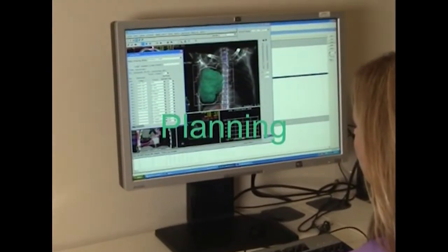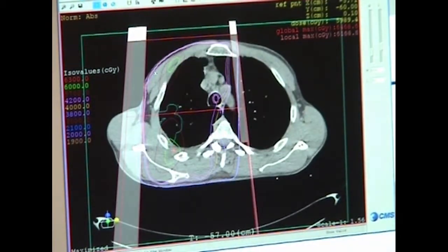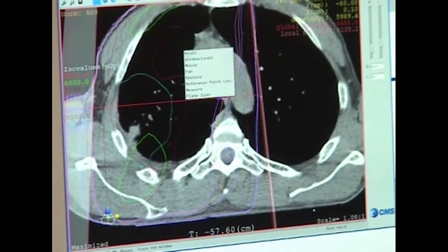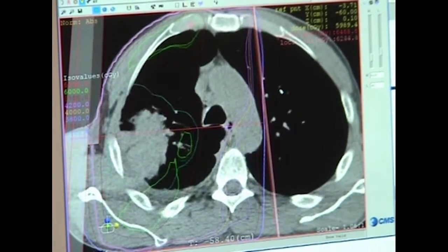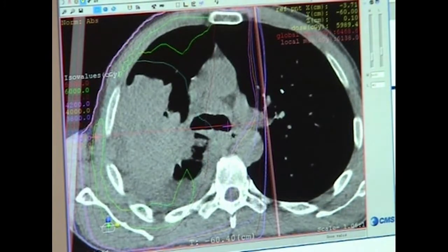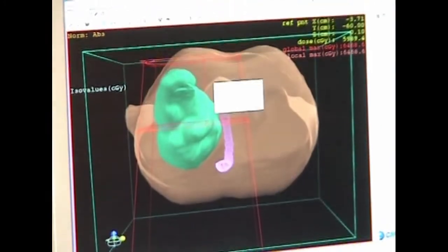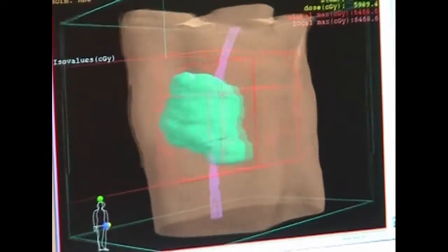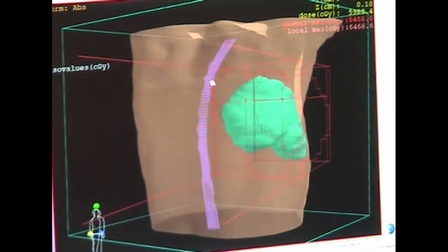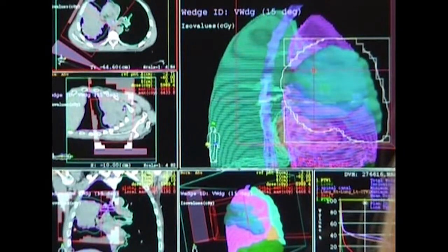Prior to your first radiation treatment, considerable effort is required to create a high-quality treatment plan that is specific to you. The dosimetrist creates your personalized radiation treatment plan. They use the information gathered from your simulation and any additional information provided by your radiation oncologist. The tumor and treatment area will be carefully outlined or contoured, as will your normal, healthy tissue. Contouring is basically outlining areas of interest within the CT scan data.